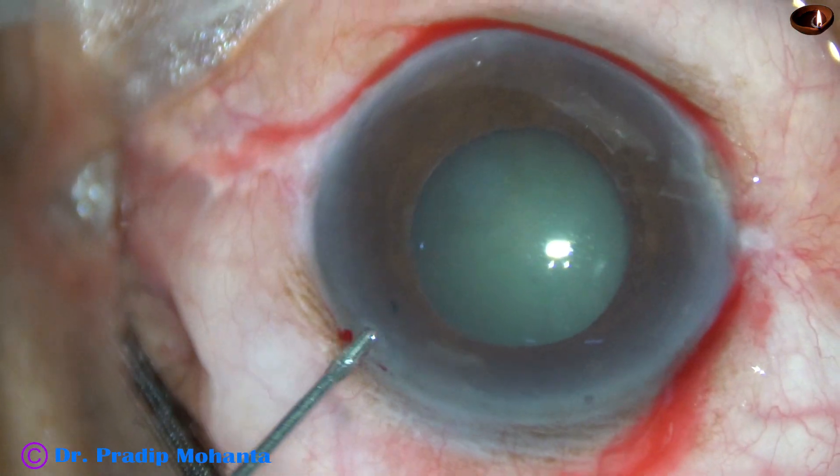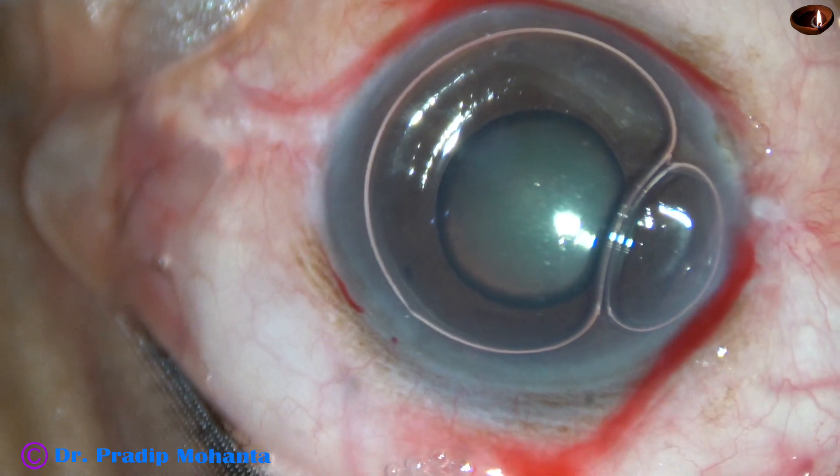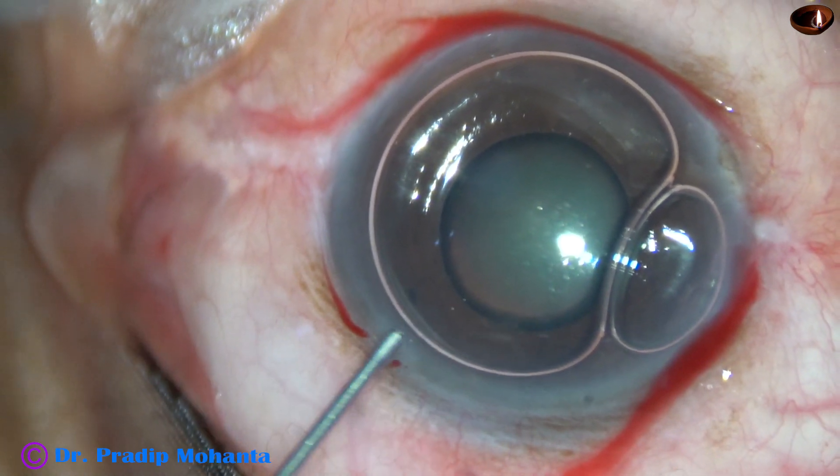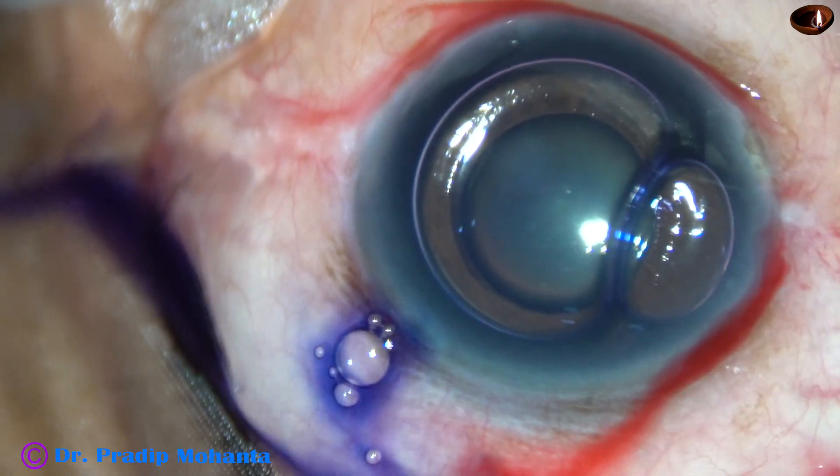An air bubble is injected to fill out the anterior chamber. Beneath this air bubble, trypan blue dye is applied over the anterior capsule.